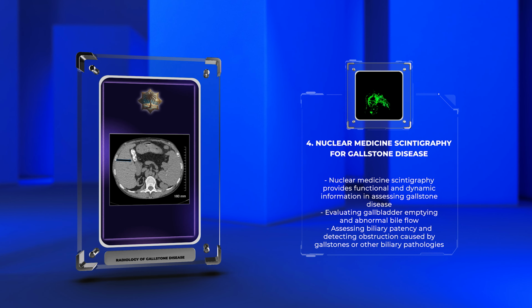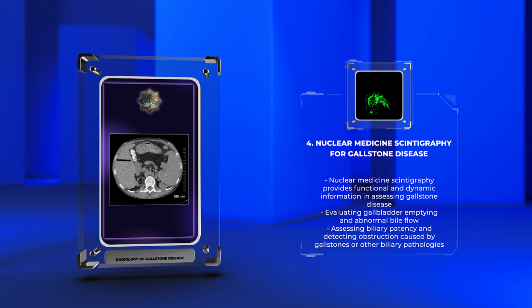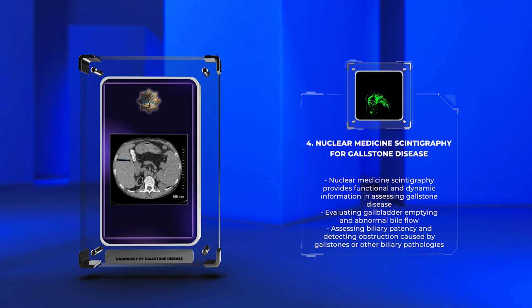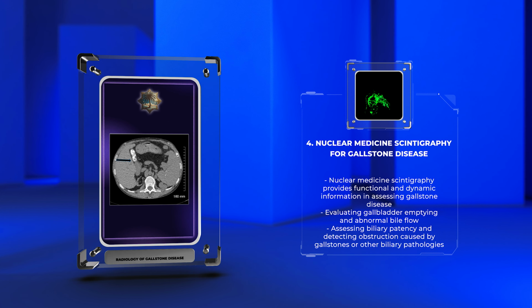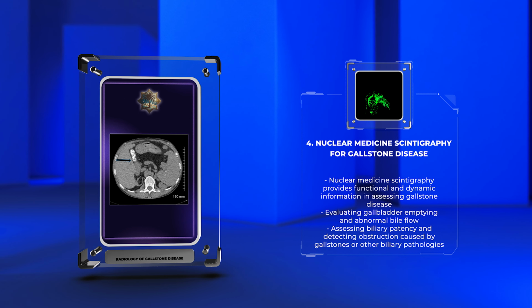This helps us identify biliary dyskinesia, a condition characterized by abnormal gallbladder contraction. Additionally, we can assess biliary patency and detect any obstruction caused by gallstones or other biliary pathologies. Scene transitions to the title of the next topic.